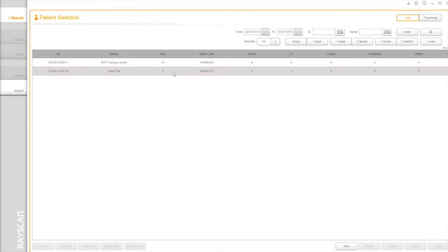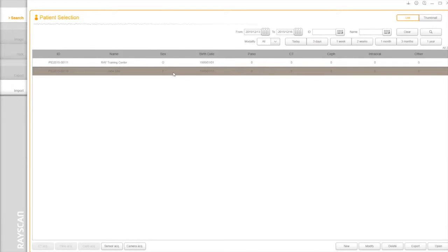You can also search by modality. The software allows users to launch the intraoral acquisition interface. Select a patient and click on the Sensor Acquisition button on the left bottom.